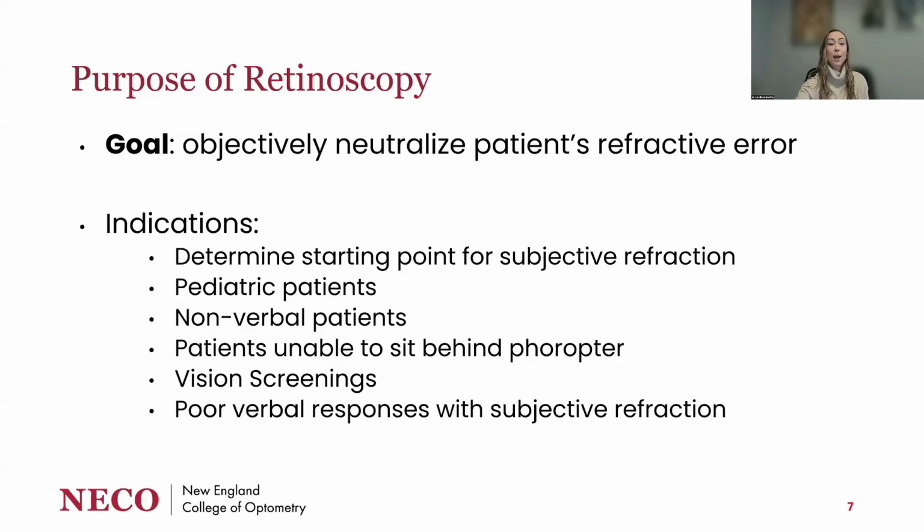Consider a patient who comes in and you have no starting point for the refraction. Maybe they brought in an incorrect pair of glasses or a very outdated pair. Perhaps they gave you their near vision only glasses and didn't realize, so you have the incorrect one in the phoropter. You could do retinoscopy to get a more accurate starting point if you start to notice that your subjective refraction in the phoropter isn't going quite as planned.